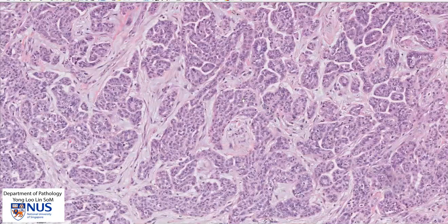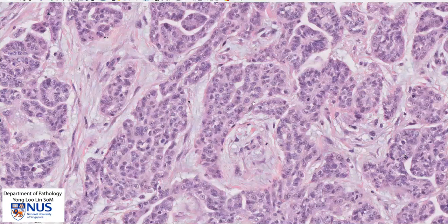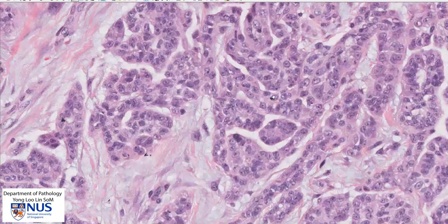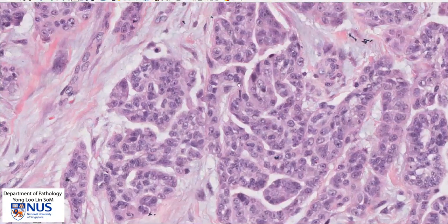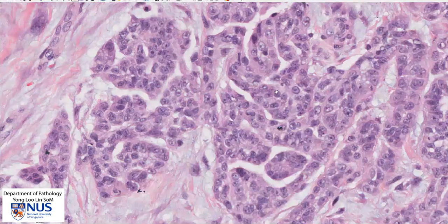Now let's have a look at the neoplastic mesothelial cells. These cells appear to be quite plump and polygonal. The nuclei are enlarged, and as we look around, we can see that some of the nuclei are quite irregular. They have irregular nuclear membranes, whereas others are rounder. So there is some degree of nuclear pleomorphism — variation in nuclear size and shape. And also one very striking feature that we see is the presence of prominent nucleoli; many of the nuclei in this particular field have got prominent nucleoli.